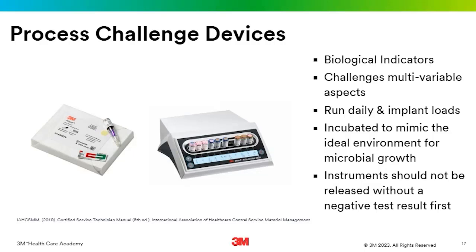Now, depending on the type of incubator you have, it can be anywhere from 24 minutes. They used to have ones that took days. If you have one that only takes 24 minutes, within 24 minutes you're going to have a positive or a negative readout.